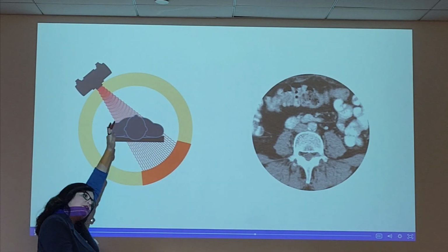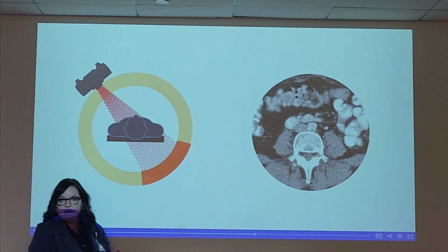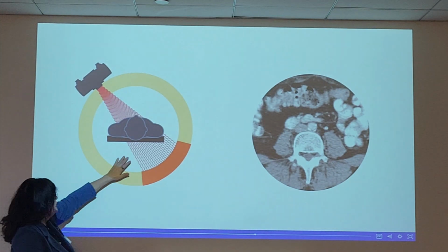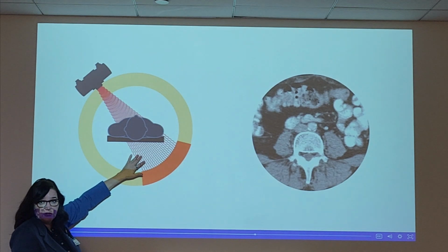they're going to bump into, and then get lost in, right, something that's very dense, and it's going to absorb it. Not enough energy to pass through it. But the energy that does escape is carrying information with it.